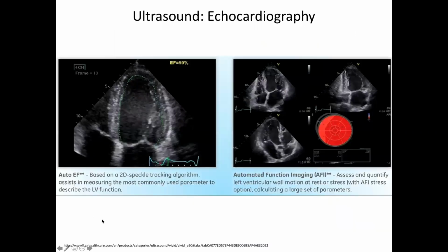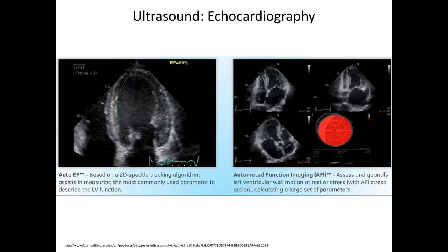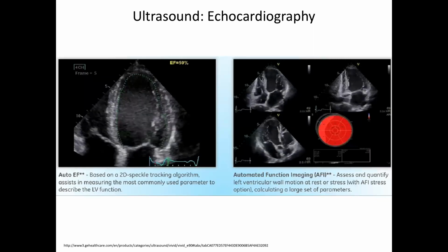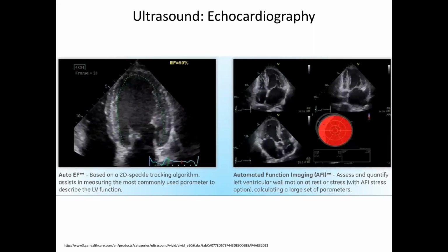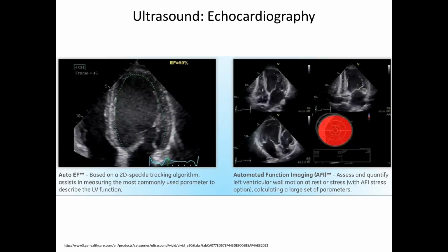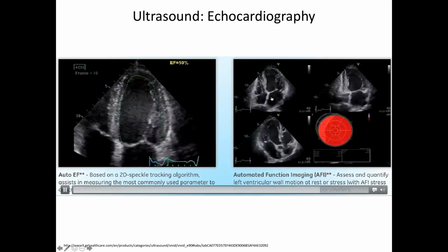Here are some examples, right? They look much better as movies. Ultrasound just looks much better when you watch the movies, right? Because your eye tends to average out the static noise on each frame as the movie passes by. And you're also distracted by the really amazing resolution of things like the valve opening and closing, right?